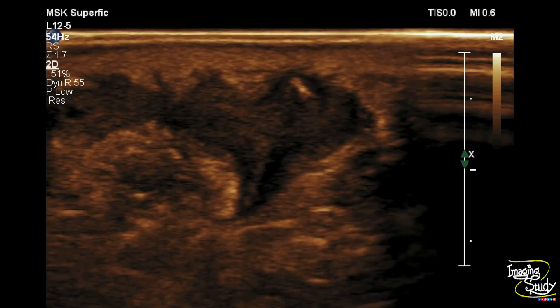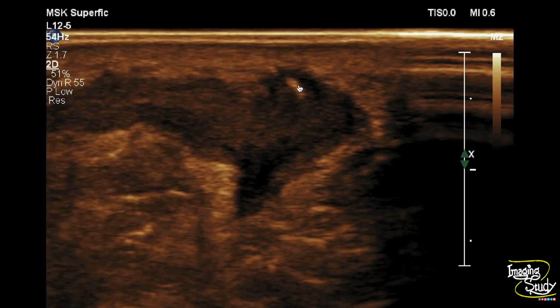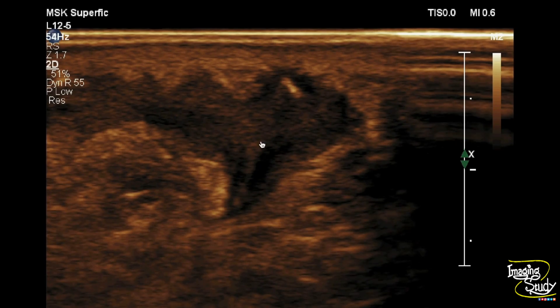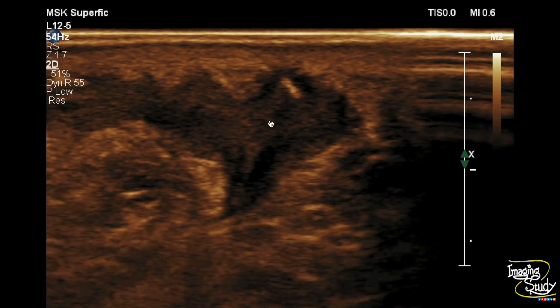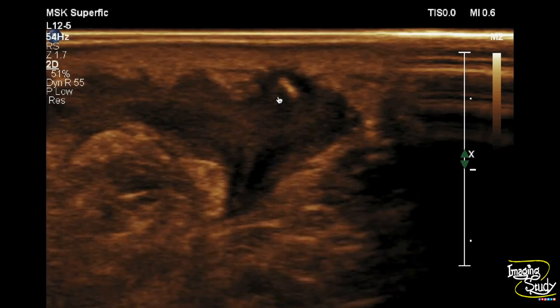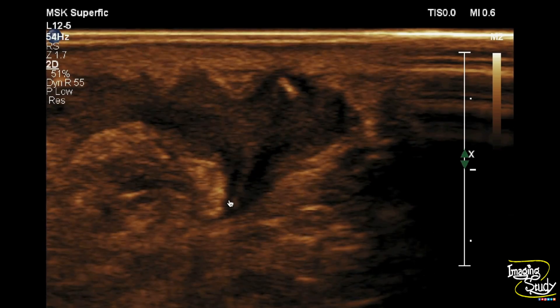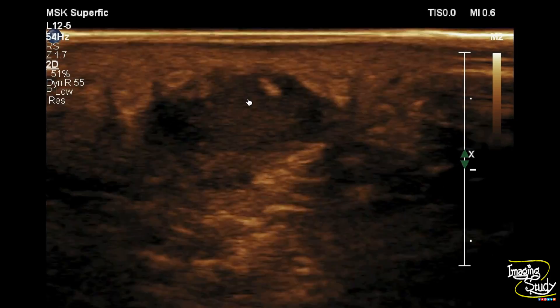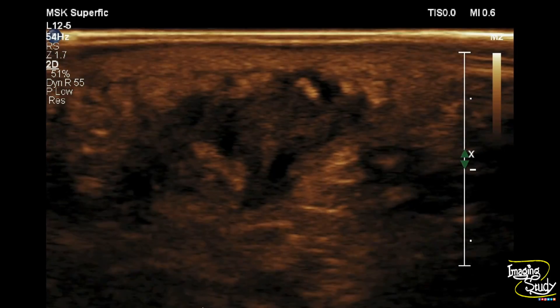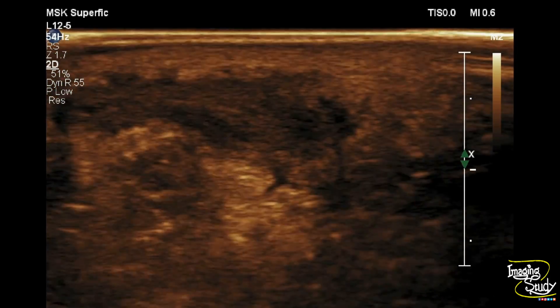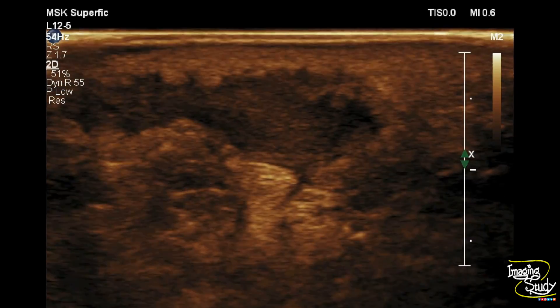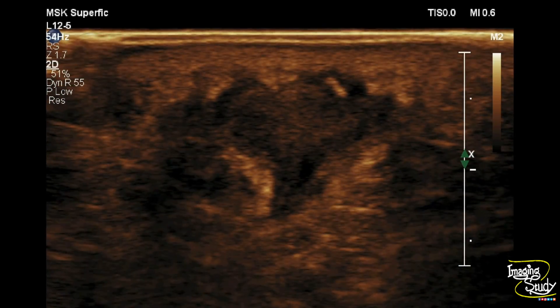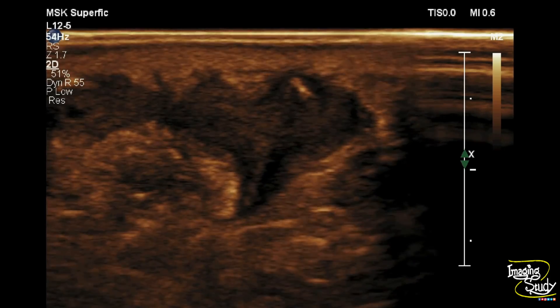Here is a more magnified view and you can see a thin echogenic linear structure within the abscess cavity. This thin linear echogenic structure is nothing but the fish bone. The patient tried to remove the fish bone with a nail cutter and it easily got impacted here, so the age of this fish bone within this area is about three months.